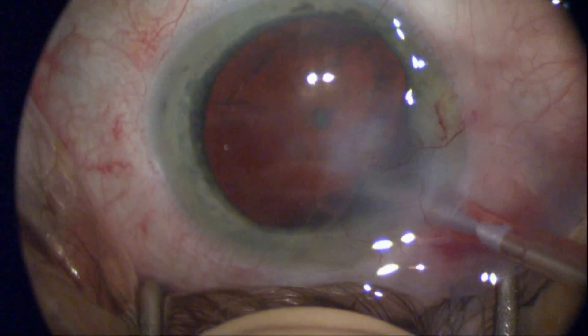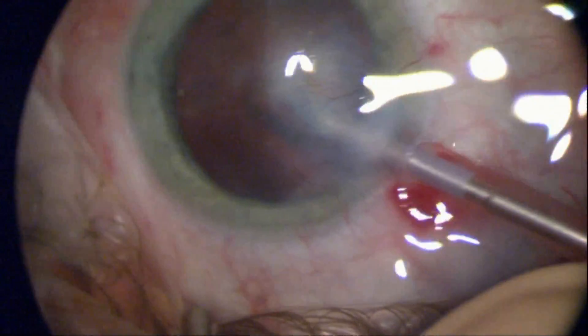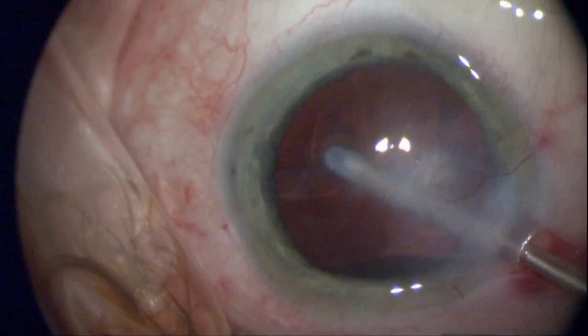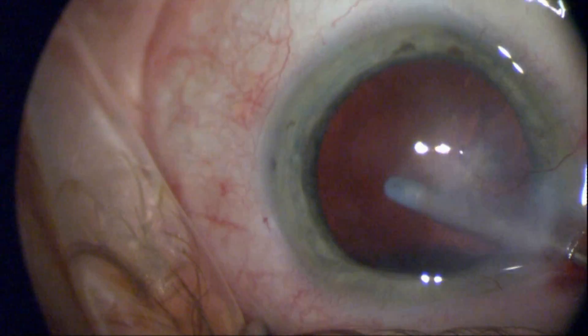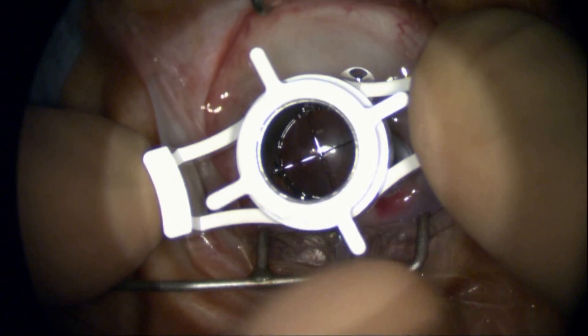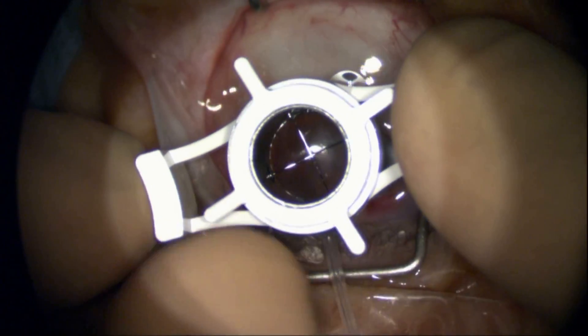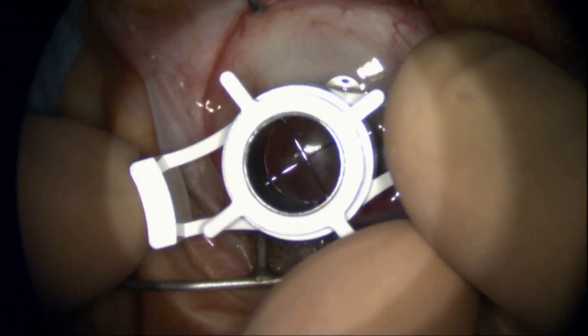I'm removing sub-incisional cortex here with the irrigation-aspiration unit, again protecting the posterior capsule. Now I can remove the cornea — I've got viscoelastic in the anterior chamber and I'm advancing the blade through the cornea very carefully.